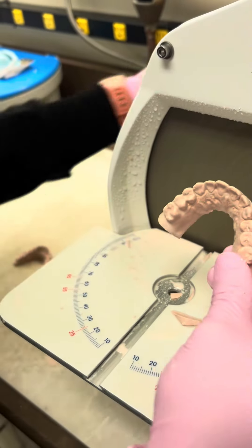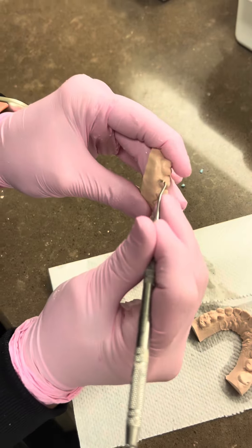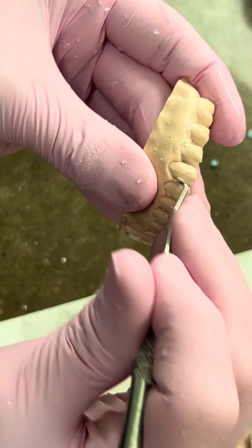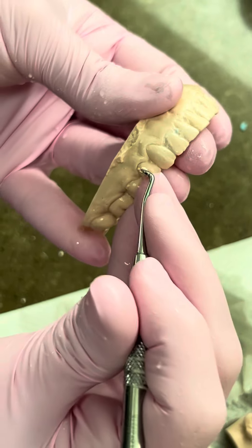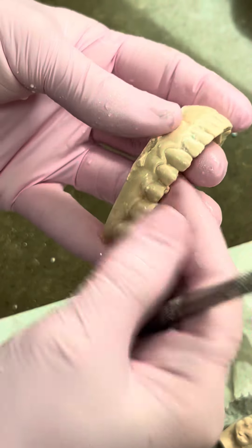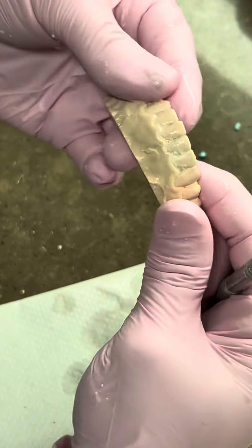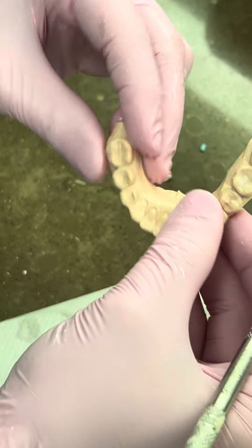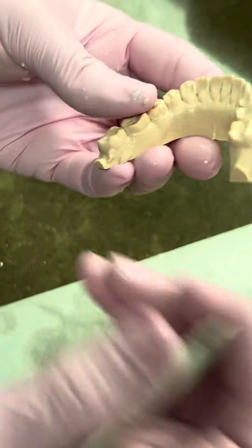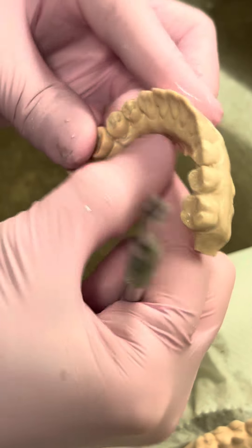I'm going to rinse it — let's get all the little pieces off of it. Wow, that is a lot of work. It's time consuming. And so we always hate it that our patients sit there and wait, but we want to make sure it's done right.